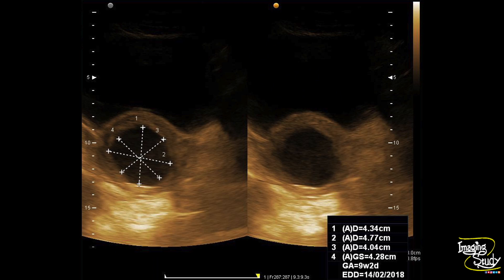Here we have taken the mean sac diameter. The mean sac diameter was 42 millimeters, suggesting a nine weeks two days pregnancy. In a normal nine weeks two days pregnancy, you will even see the movement of the embryo, and we can't see any embryo here. So this is actually a case of blighted ovum.